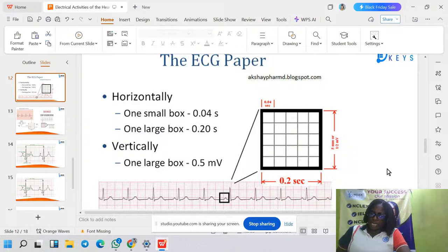If you get 80 and you get 90, which option will you pick? 84 is the closest option. Even if you got 90 and I got 80, the closest to our answers is option C, which is 84. And that's how to use the R to R method.